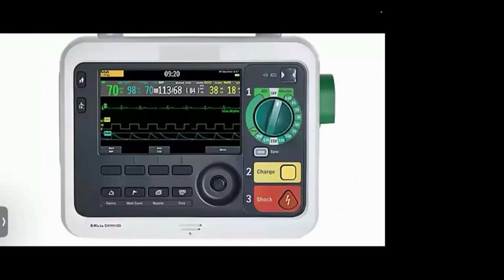Now, if you see the controls of this particular device very carefully, there are various knobs. The first dial, on the top right, the green dial, shows the amount of energy that you can provide to the patient, and the numbers are denoted in joules. Next, you have the charge button and the shock button. When you press the charge button, this machine stores the electric energy. And when you press the shock button, it provides the electrical current to the patient.